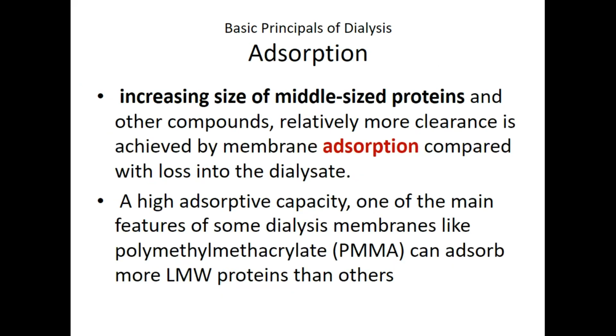In adsorption, with increasing size of the middle-sized proteins and the other compounds, relatively more clearance is achieved by membrane adsorption compared with loss into the dialysate. A high adsorptive capacity is one of the main features of some dialysis membranes like polymethyl methacrylate, PMMA membrane, which can adsorb more low molecular weight protein than others.